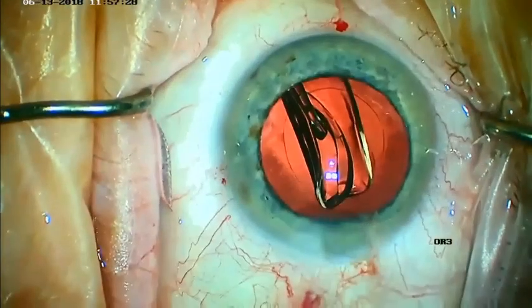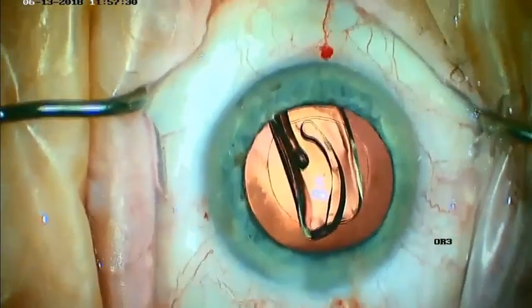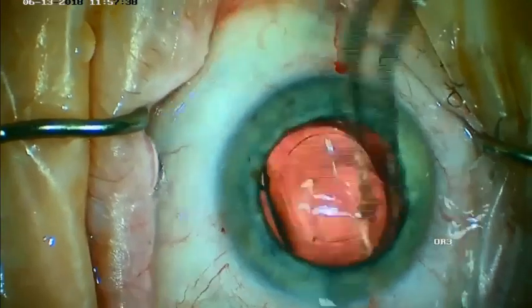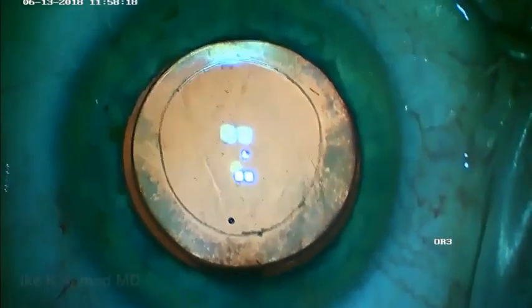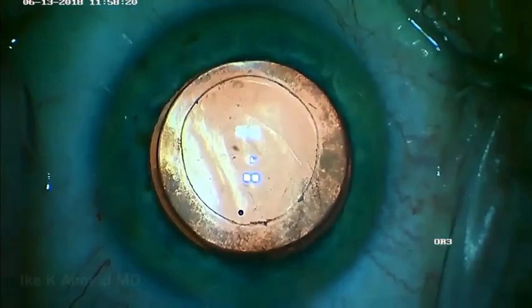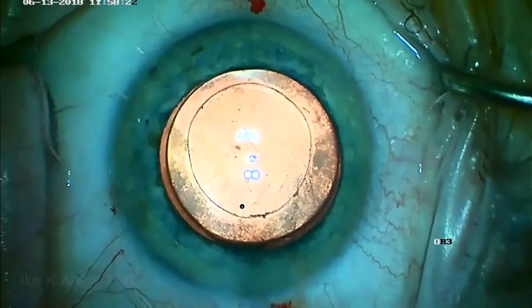The beauty of this device is consistent capsulotomies — 5.2 millimeters in size — creating excellent overlap of the IOL with excellent strength. This is one of the most critical aspects of safety in phacoemulsification, as well as effective lens position and the precision of the refractive result.